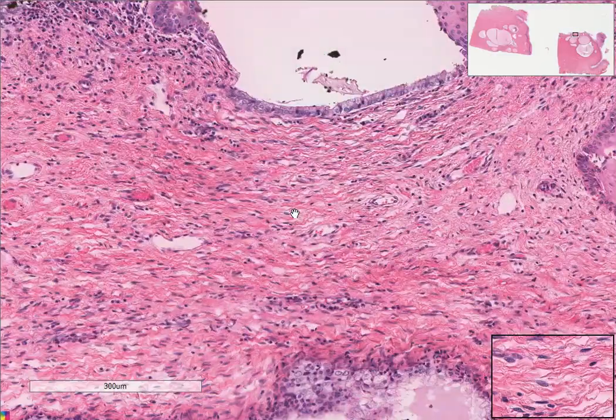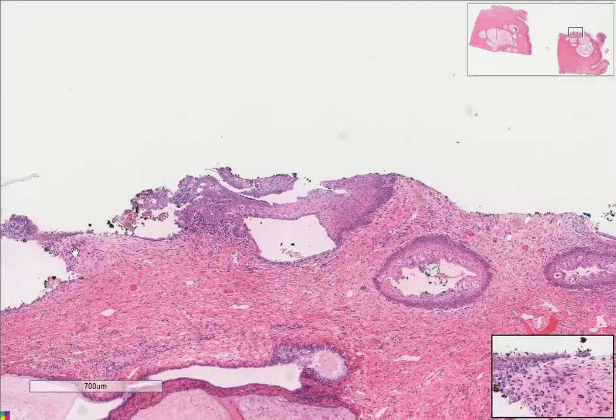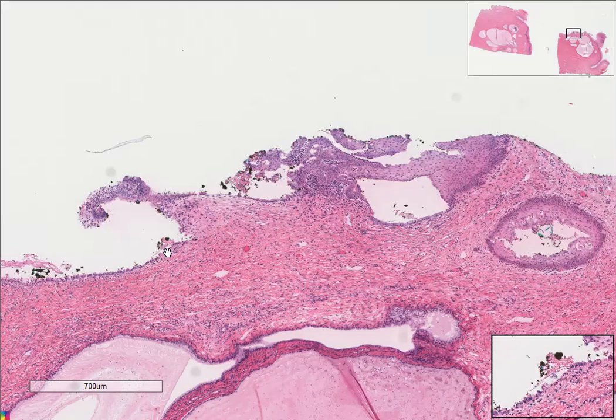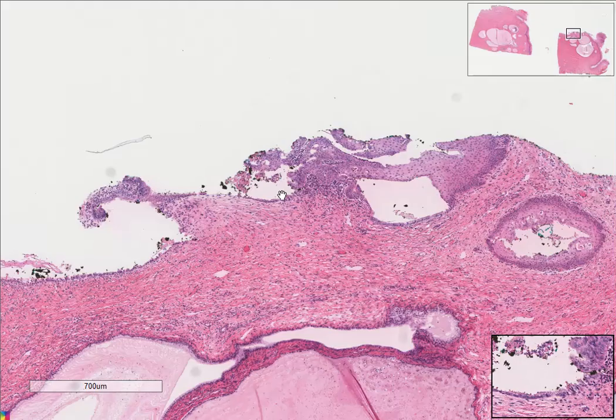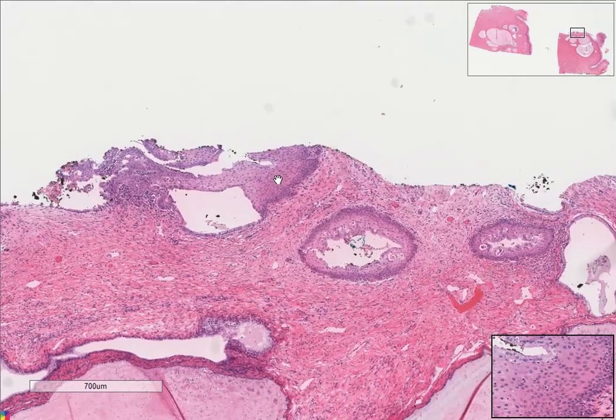Now, if you remember, there is a squamocolumnar junction, which occurs in the cervix and tends to vary with age. It may vary between teenage and menopause. So you can see here, there is simple columnar epithelium, and then it goes here and changes into a stratified squamous epithelium.